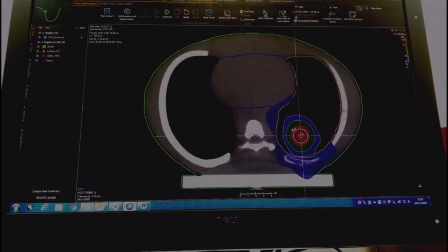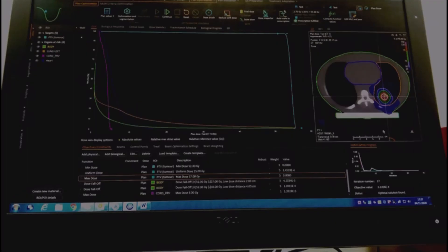Plenty of radiation energy is being deposited in the tumour area, and you've not got too much going to the heart or towards the cord. The treatment would be used on the patient once all the relevant checks have taken place.